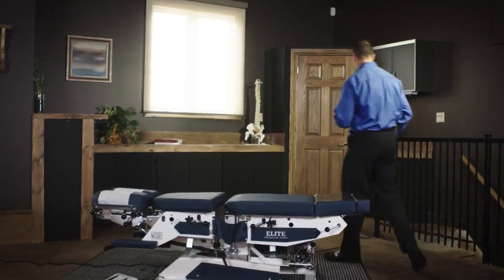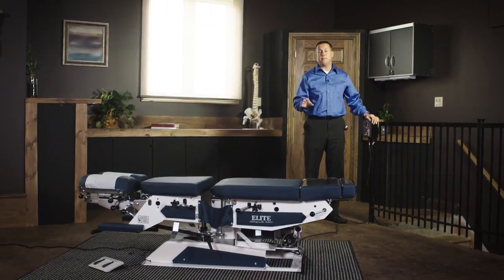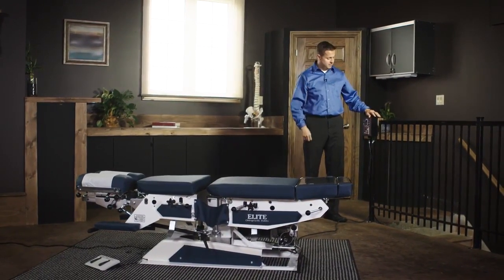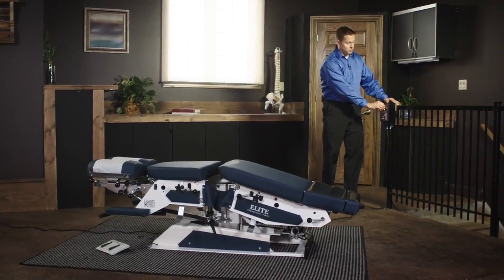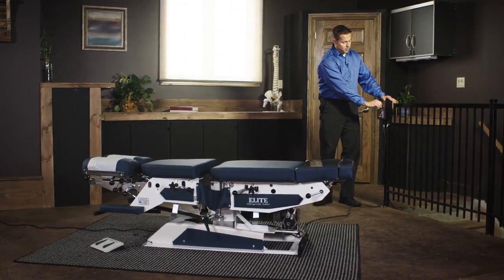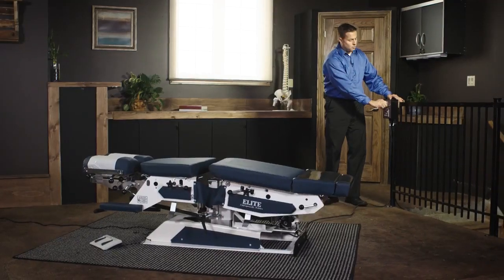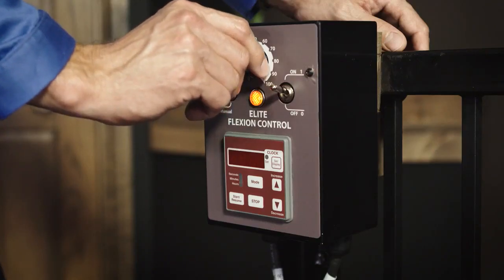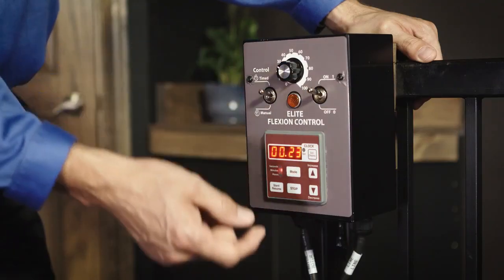This table has a control box which can be mounted on a wall, on the table, or on a stand. You can turn on the table and it will go through its motions. You can also increase or decrease that speed. This can also be timed as well.